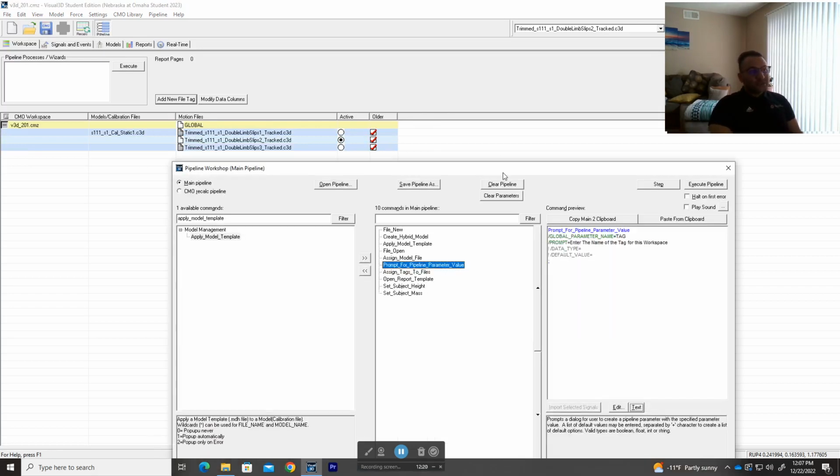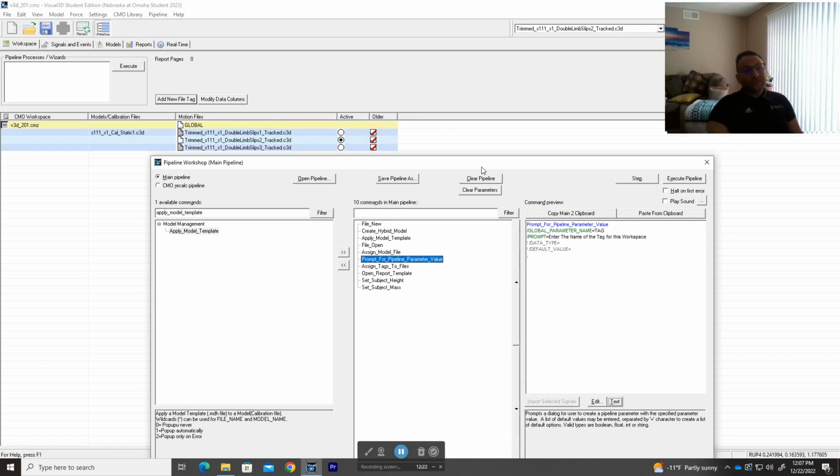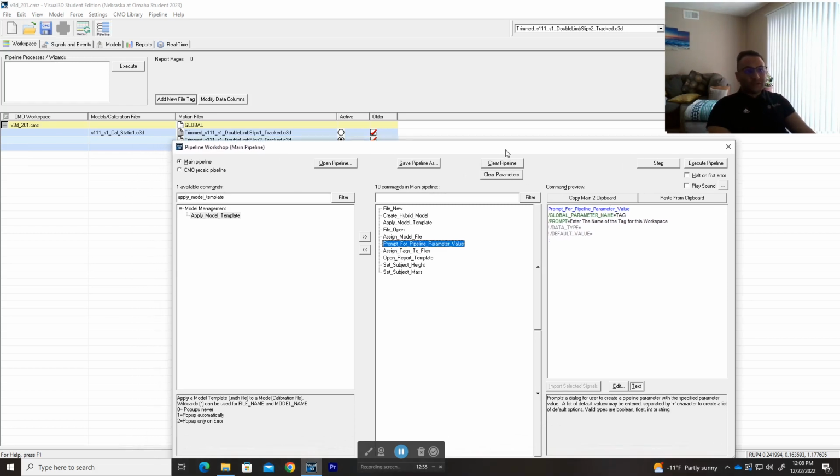Alright. Also, it's not just about younger or older adults, whatever groups you have. So for example, we have fallers and non-fallers: those who slipped but did not fall, and those who actually slipped and fell. We measure that by the amount of load added to the harness, because we have a load cell attached to the harness. If they add more than 30% of the body weight, then that's considered a fall.